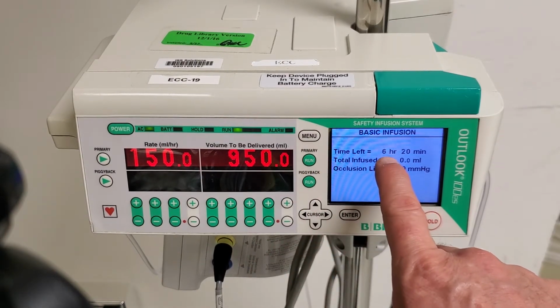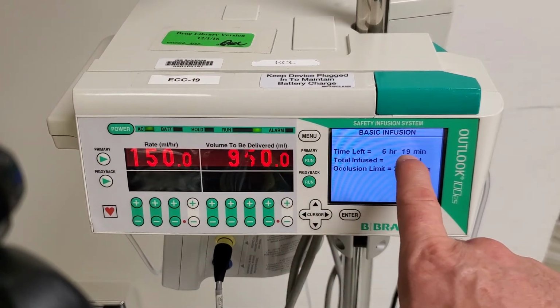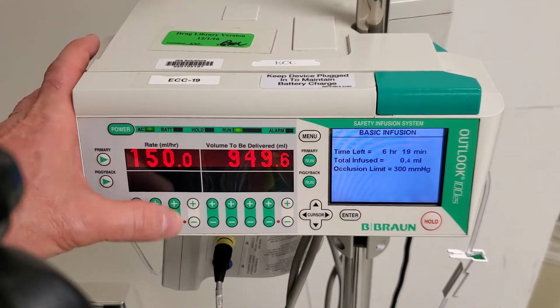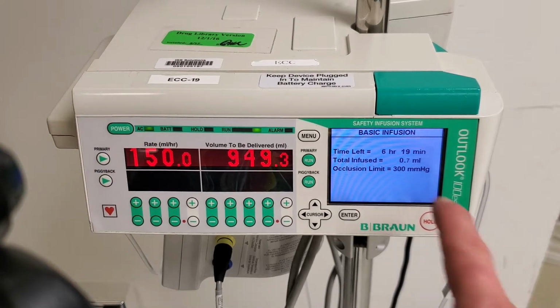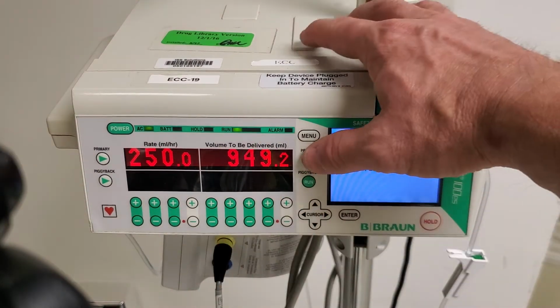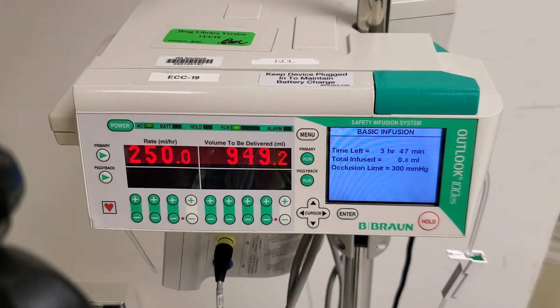The pump calculates what the amount of time is to deliver this volume, and it's 6 hours and 19 minutes. To titrate this drip, we will use the plus or minus keys beneath the decimal places. So we'll change from 150 to 250. Notice how the time will automatically be recalculated. Once we make a change here, we have to hit run to confirm it. Now our new time is 3 hours and 47 minutes.